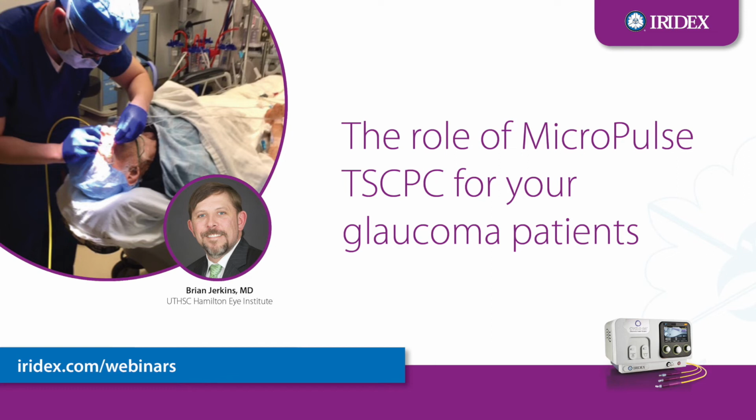Question, what are your long-term results, say out 1 year to 2 years, in some of your MicroPulse patients, and what do you do if they fail late? For these examples, I did only go out to 6 months. As mentioned, I've been doing this probably 3+ years at this point, and I'm still following many of those patients. I've not had many that tend to change course after they settle down after 5 to 6 months. So I feel like that is similar to maybe an SLT patient when they hit their kind of plateau for a little while.